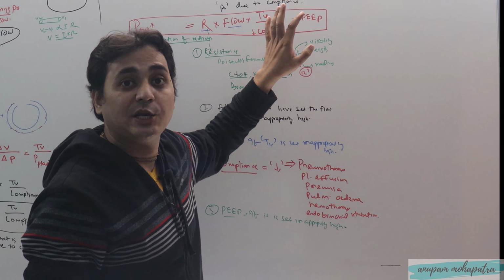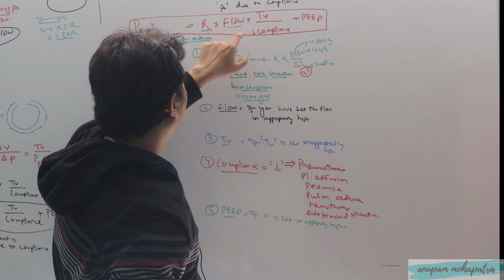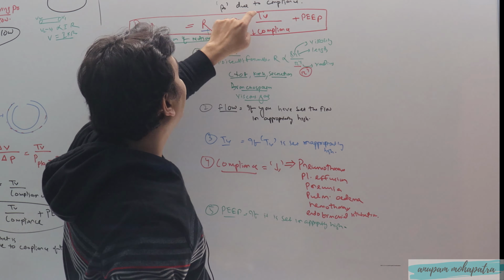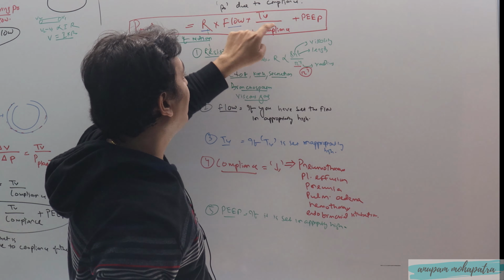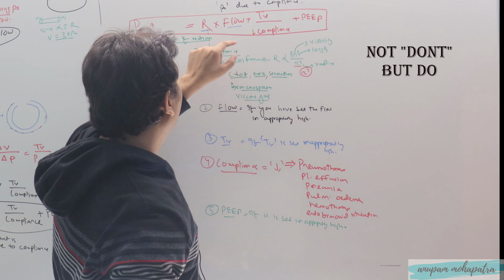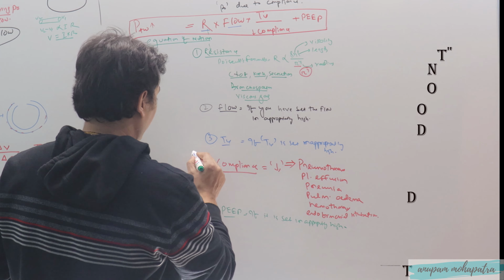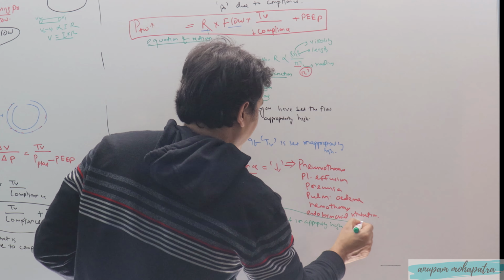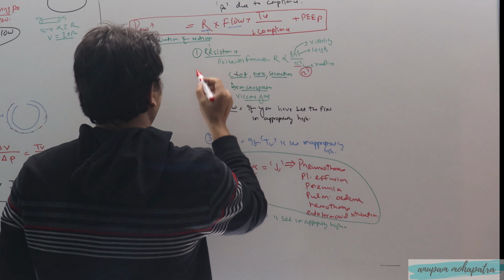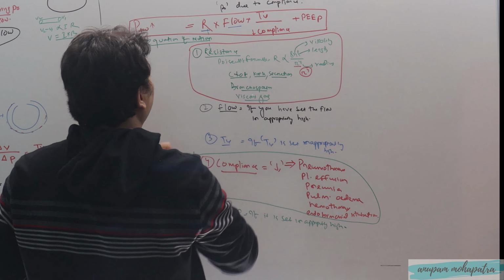It cannot suddenly increase the airway pressure too much, but it is the other thing, the resistance and the compliance factor, that will start increasing the peak airway pressure, and the PEEP can compound it like resistance, like flow, tidal volume. The PEEP can compound it and make it look larger. So do not first try to fix the PEEP; look at the resistance and compliance component. So these two things are very important, the compliance factor and the resistance factor.